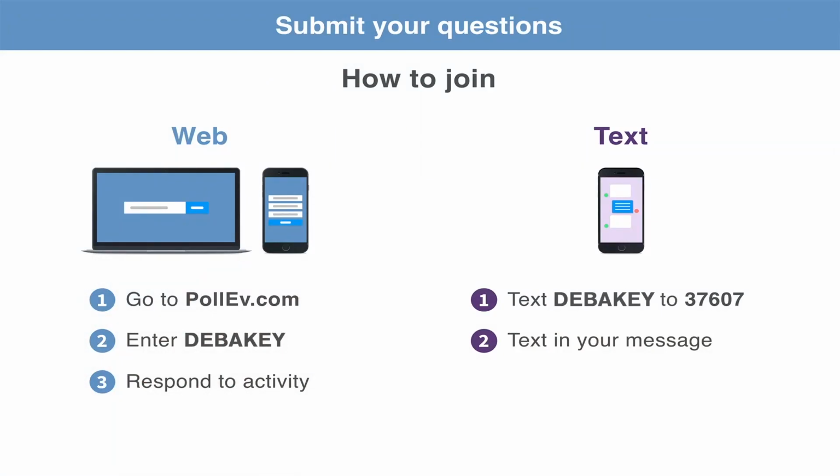Any questions? This is your time to ask questions. Anybody? Any comments regarding Hounsfield units and the connection between pannus and thrombus? How good is it? I mean, how much are you deciding whether to use thrombolytics or not? How much do you rely on it?